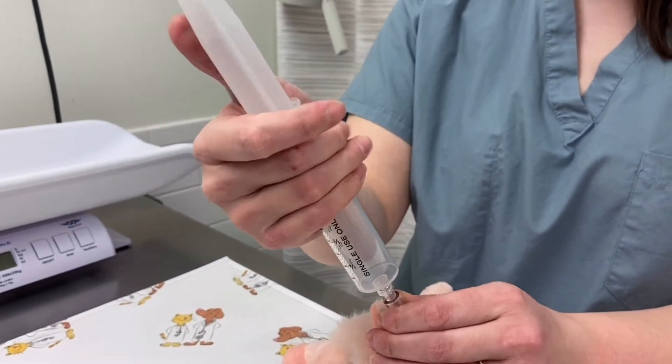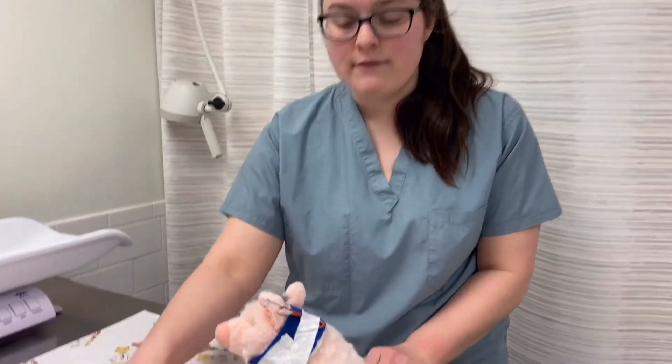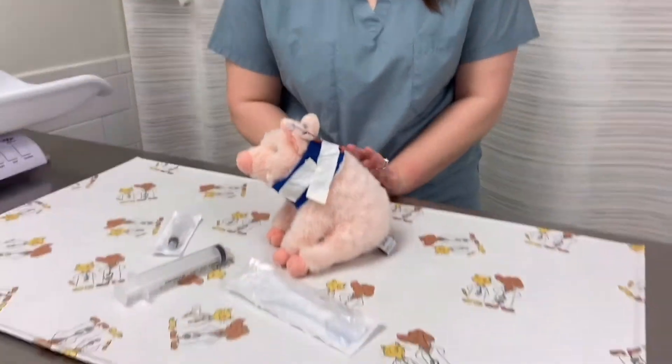You'll know if they're doing okay based on how much you're giving per minute. They'll start to show signs of nausea if you're going too fast, which would be lip licking, abdominal growling or discomfort, trying to get away from you, vomiting, or excessive swallowing. Those are signs to slow down or stop and try again a little later. If your pet does vomit, stop the feeding and don't try again until the next scheduled feeding time.